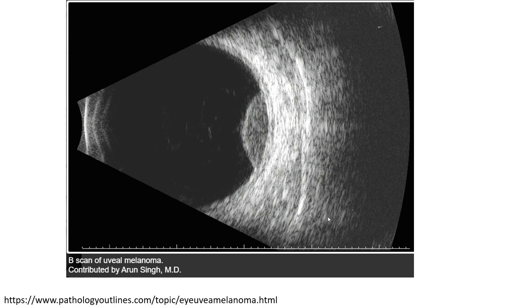This is also a case of ocular melanoma on ultrasound, where you can see the shape is dome-shaped with some internal echogenic features.